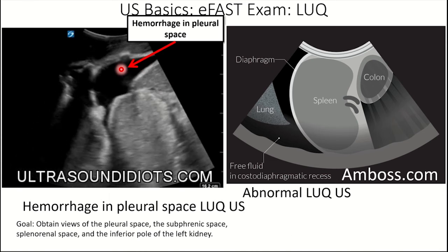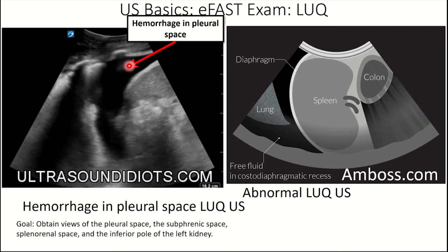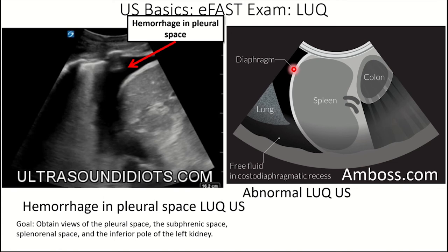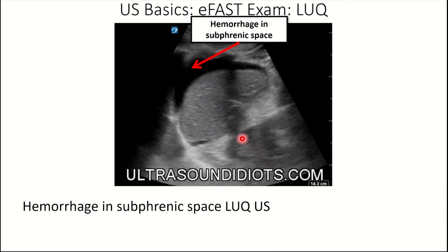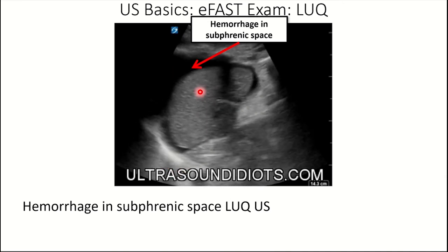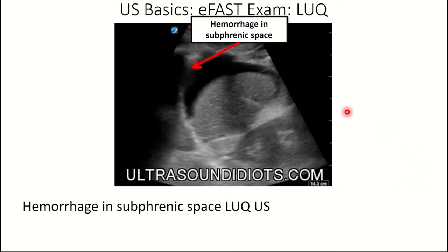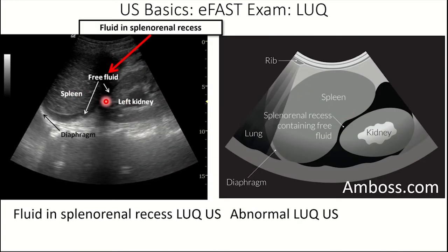Here's hemorrhage in the pleural space on the left side — the lung is waving, we see the diaphragmatic stripe, the spleen, and anechoic fluid most likely representing hemorrhage in a trauma patient. Here is hemorrhage in the subphrenic space — the diaphragmatic stripe is disconnected from the spleen with black anechoic fluid in between. And here is free fluid in the splenorenal space — you can see the kidney, spleen, nice diaphragm, and free fluid.